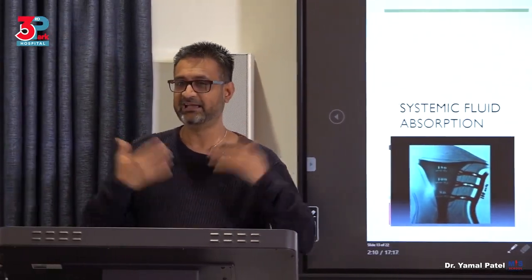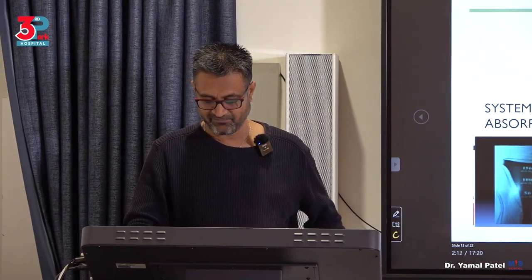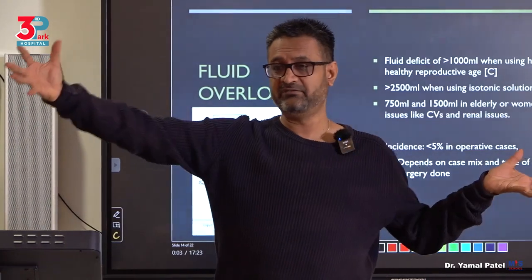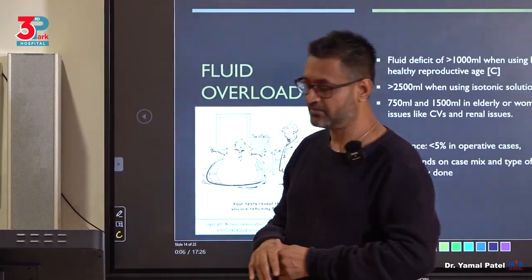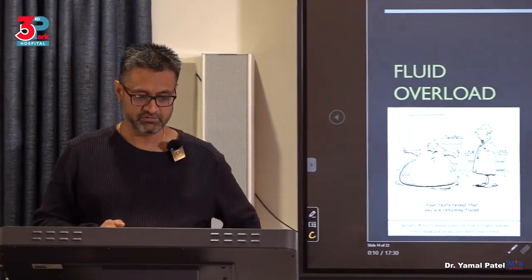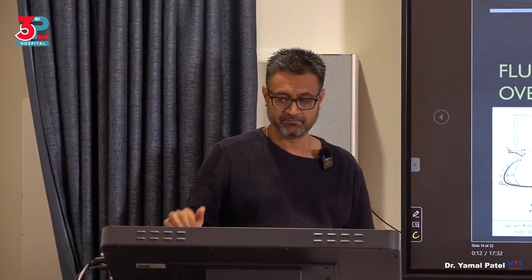And the size of the uterine cavity, when you have fibroids and all that stuff, there are very many, adenomyosis, the uterine cavity is bigger, so you have a higher chance of absorption, okay? Fluid overload. This is your problem.